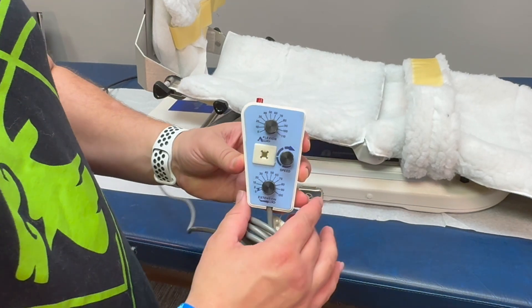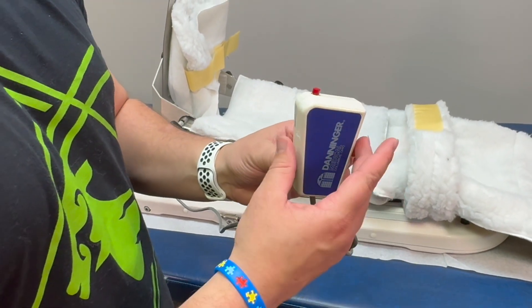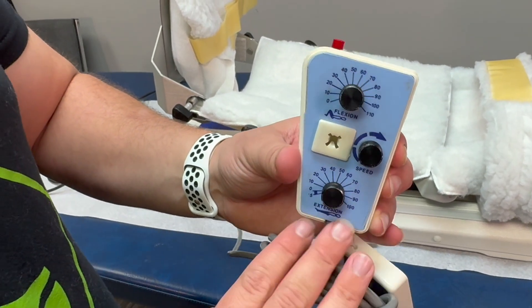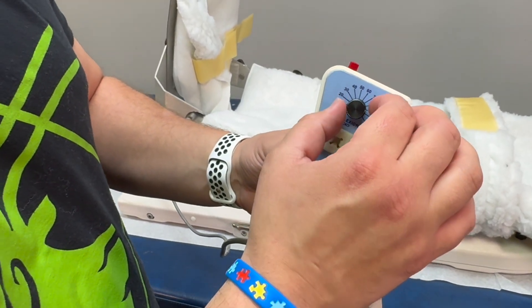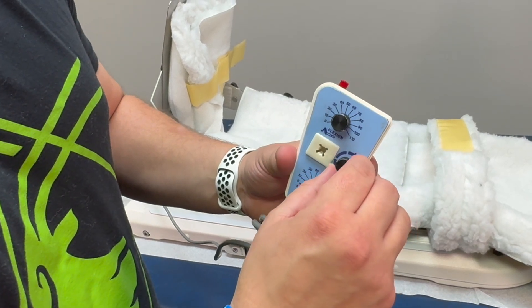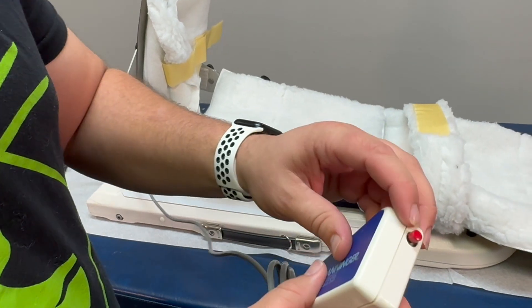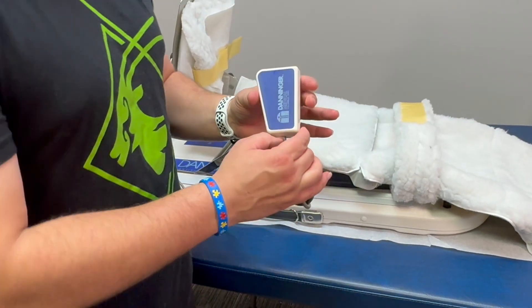This is one of our other models of CPM. The control panel is a little different — just pull it right off to access it. You have your extension settings, flexion settings, and your speed adjustment. As mentioned, we don't ever need to touch the extension setting unless directed by your physician. Flexion you can adjust accordingly to whatever degree is instructed. Then you have your speed to control how fast the machine moves. Once you have everything set, you have your start and stop button — press once to start, push again to stop. That is how you work our other CPM model.